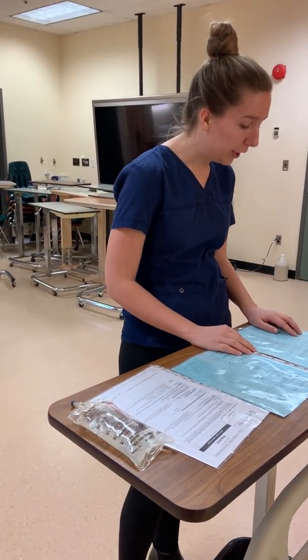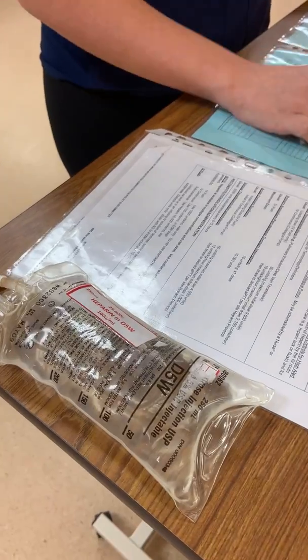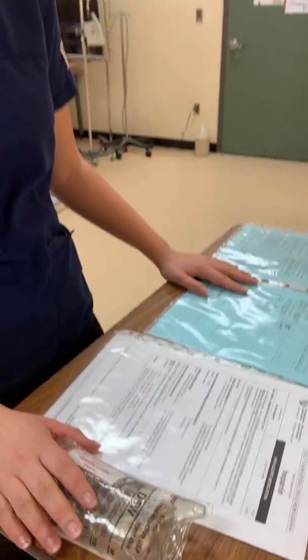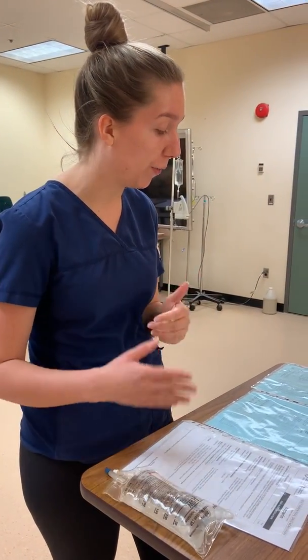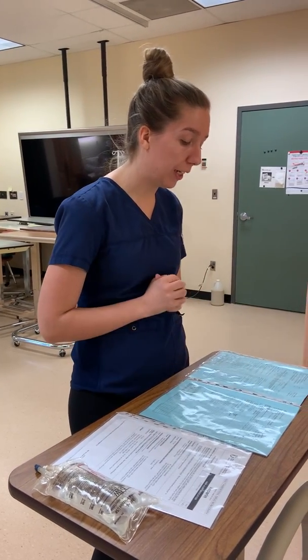They're to receive 1350 units an hour according to the physician's order, and on the MAR, I see 1350 units an hour. This bag has a total dose of 25,000 units, so I am able to retrieve the correct dose from this bag, so I have the right dose. It's to be given via continuous IV, the right route, and the next time and frequency is now.